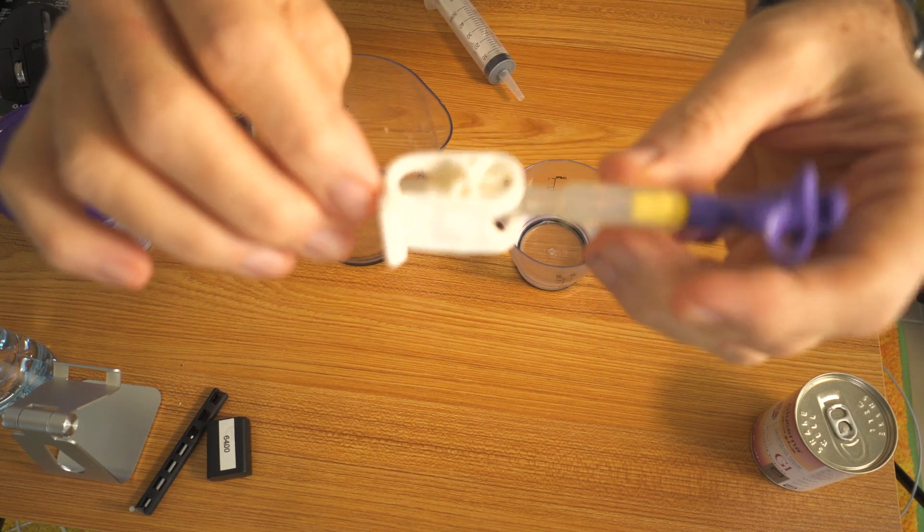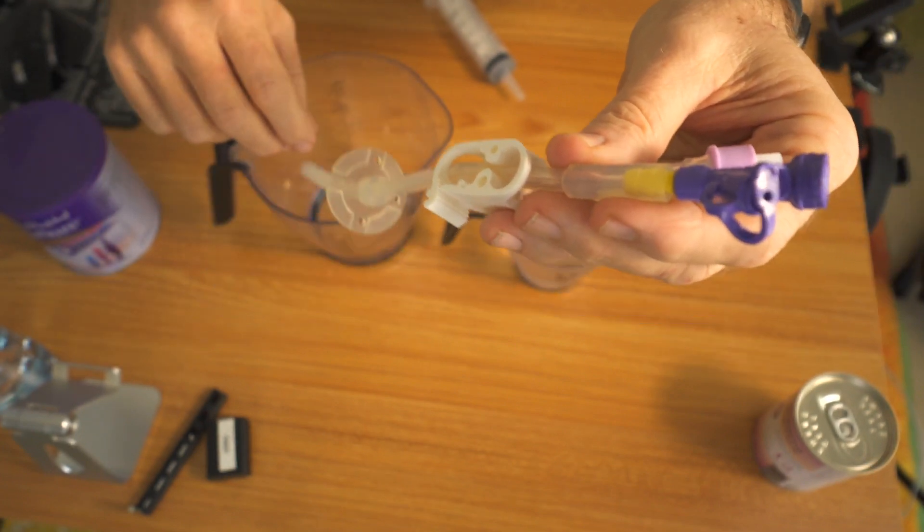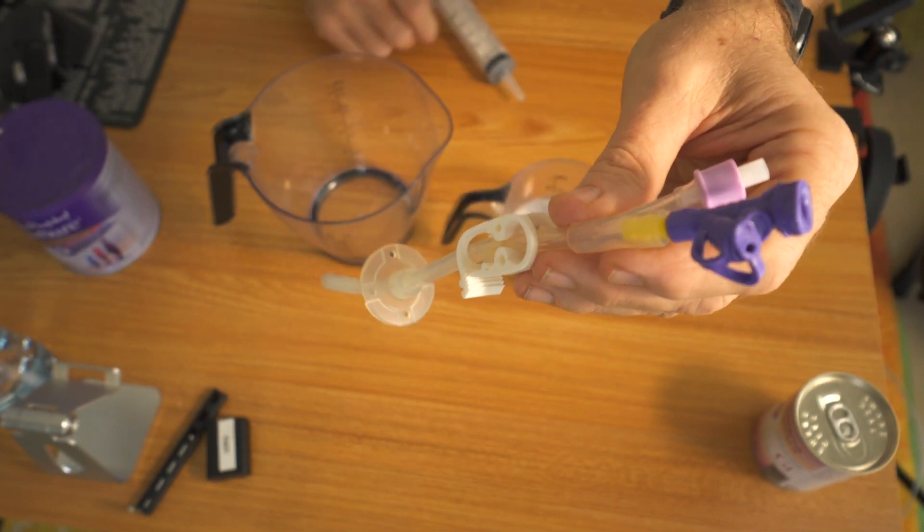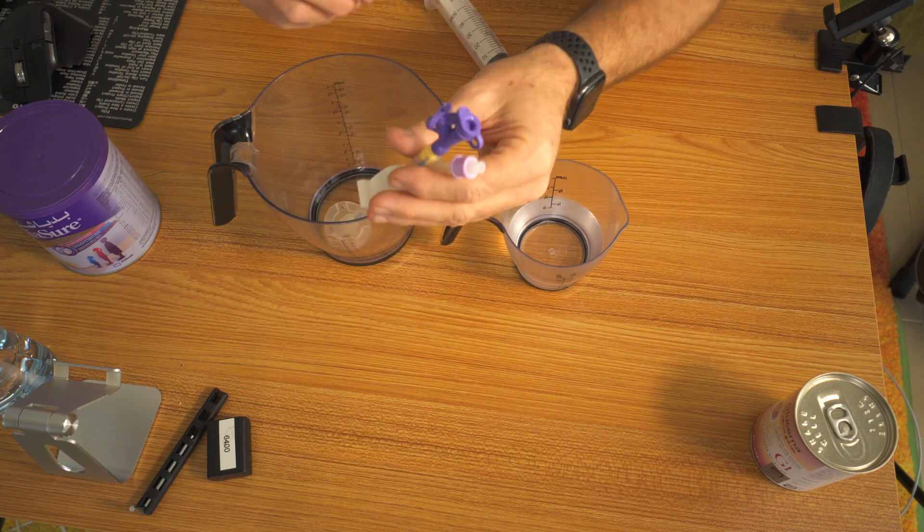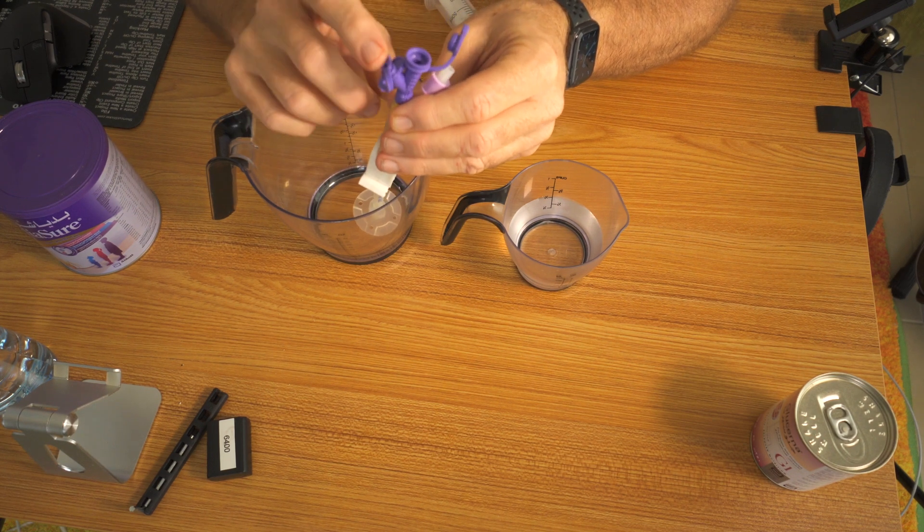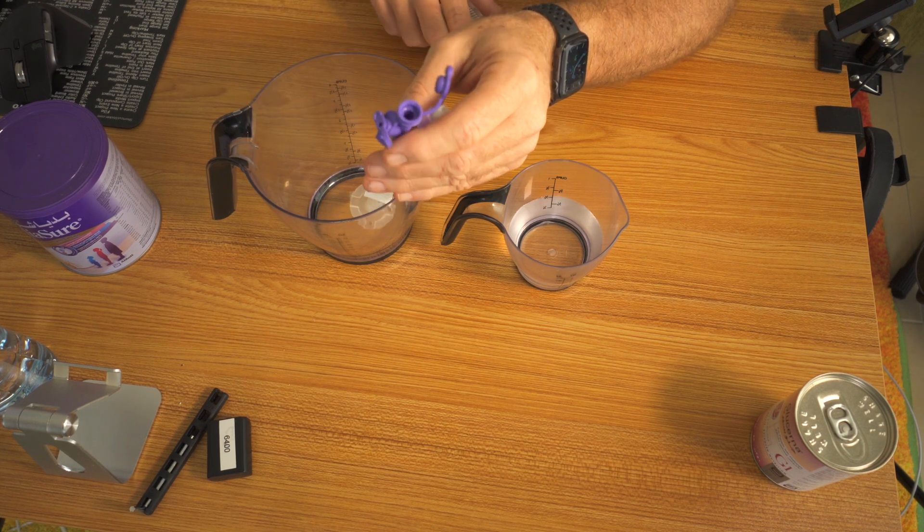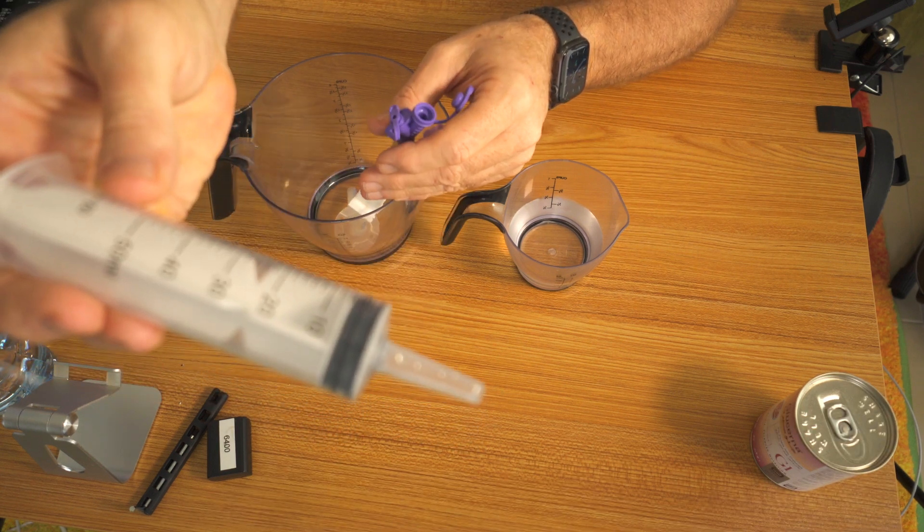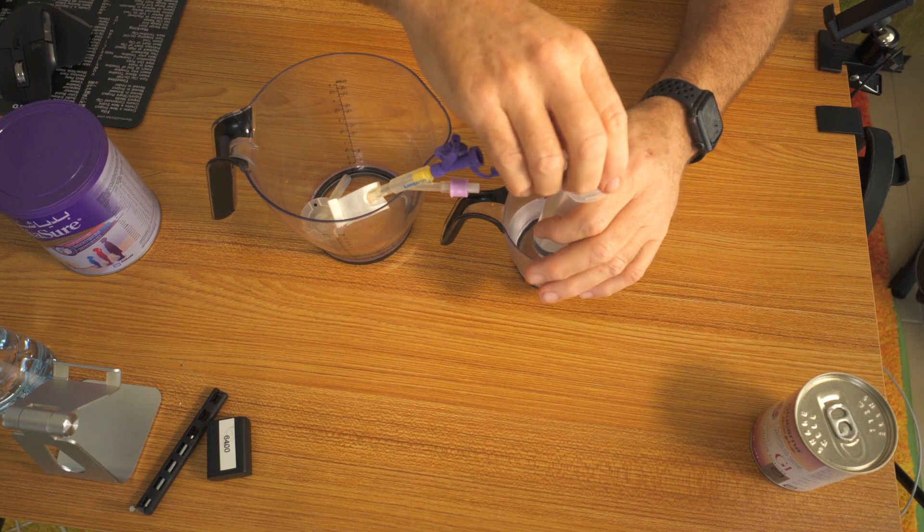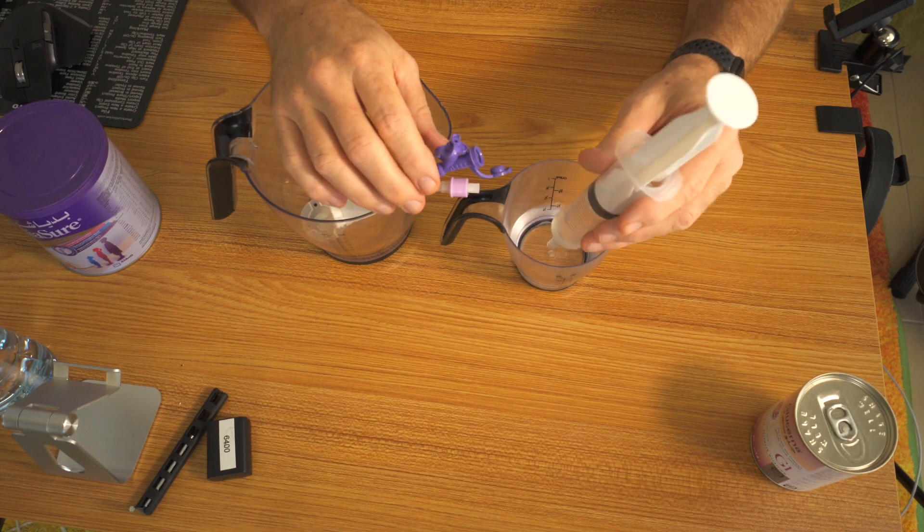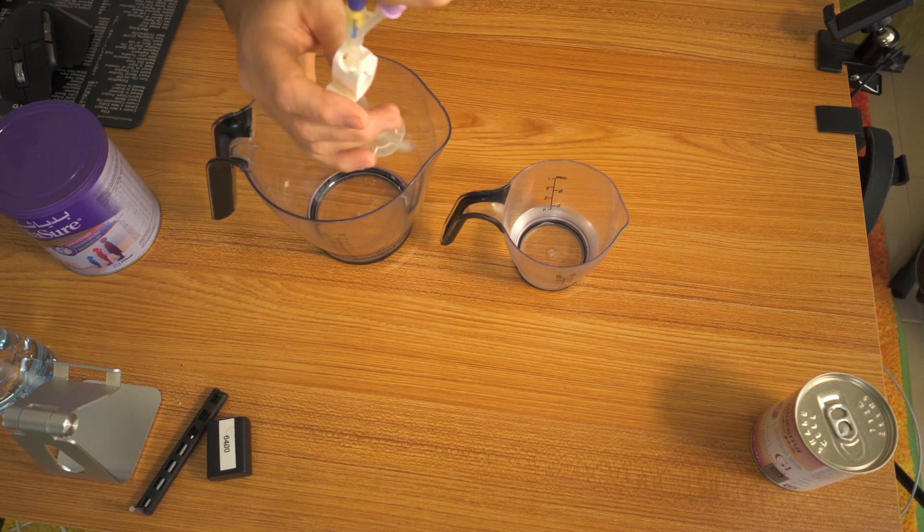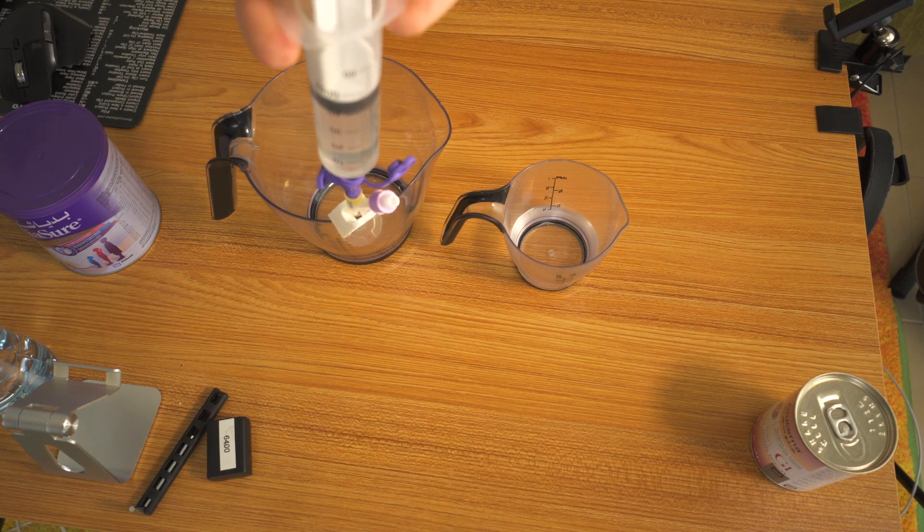Next thing we'll do is make sure the top is open. You'll notice on the PEG tube you have a feed port and a cleaning port, two different ports. Use the feed port. That's a little bit bigger and it's easier to get your syringe inside. First thing to do is take a little bit of water, pull it up inside, insert the syringe into the feeding tube like so, open the clamp like that, and then slowly slide it back.